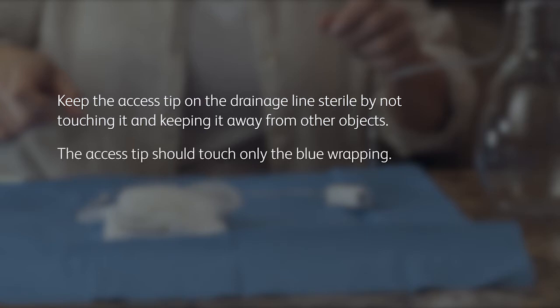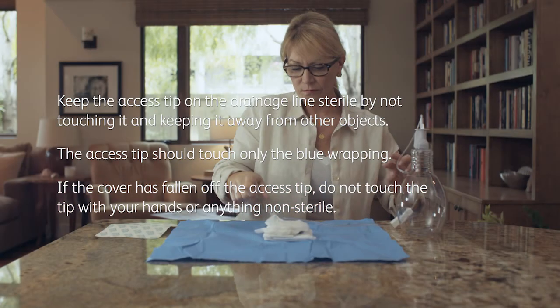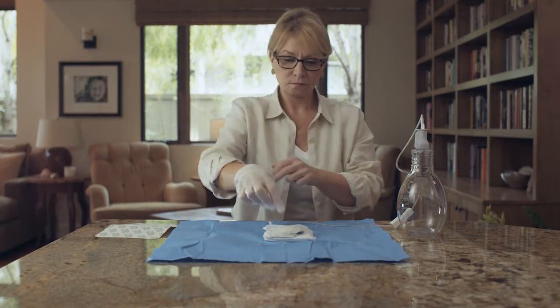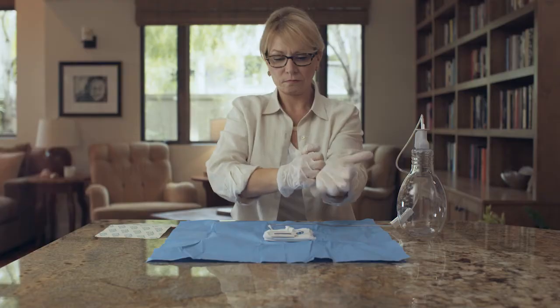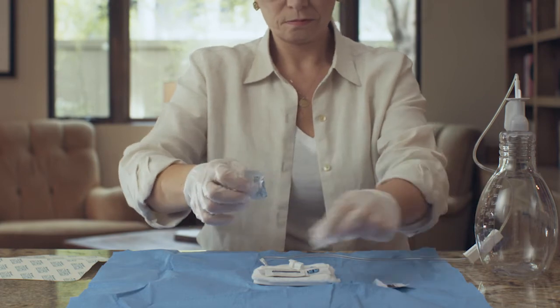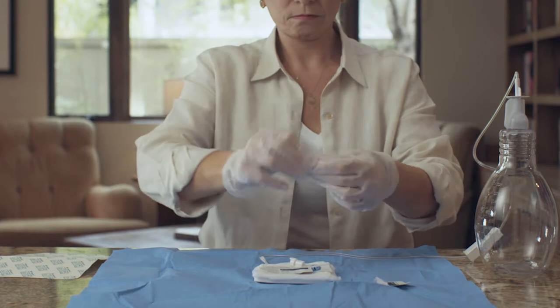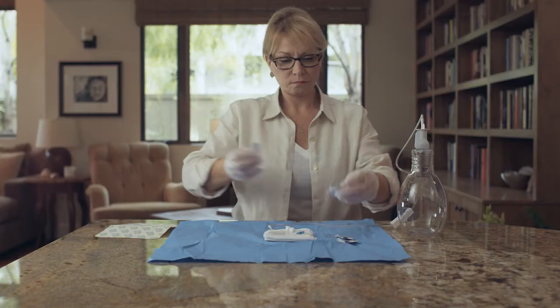The access tip should touch only the blue wrapping. If the cover has fallen off the access tip, do not touch the tip with your hands or anything non-sterile. Pick up the gloves by the folded cuffs at the wrist and pull them on. Both gloves fit either hand. Keep your gloves away from non-sterile items such as skin or clothing. Next, open all three alcohol pads and place them on the blue wrapping, but do not remove the pads from their pouches. The alcohol pads are flammable — do not expose the pads to an open flame.